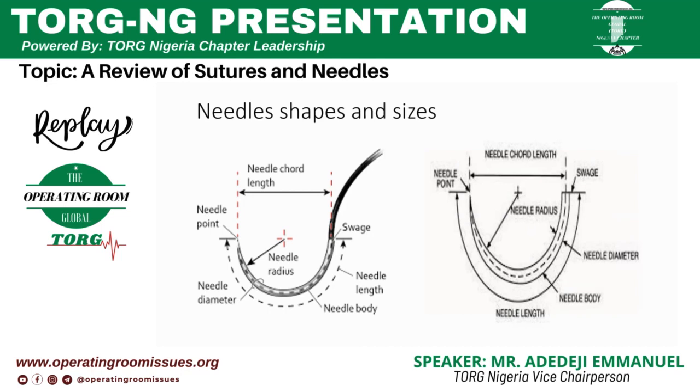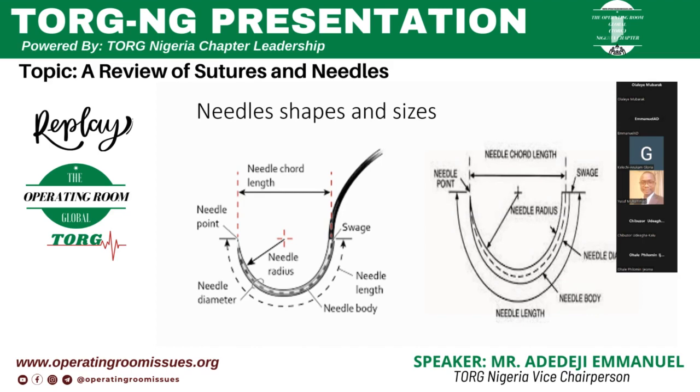Most times muscles are just allowed to come back together because muscles are highly vascularized, so you don't pick muscles. Most times you might just use a blunt needle to run the suture around the muscles. But if you are going for something like a fascia, you are going for thick aponeurotic fascial layers. We are going for scalp tissues.